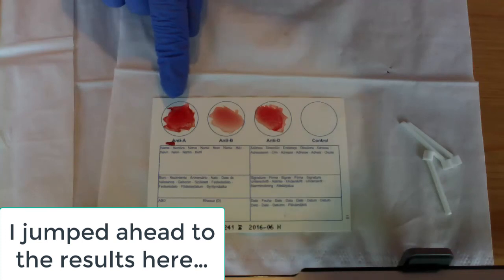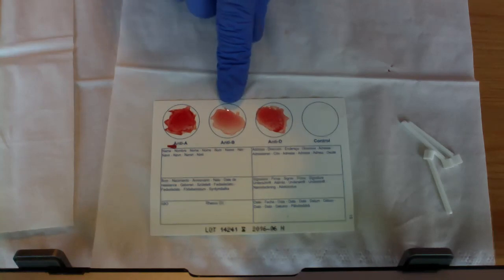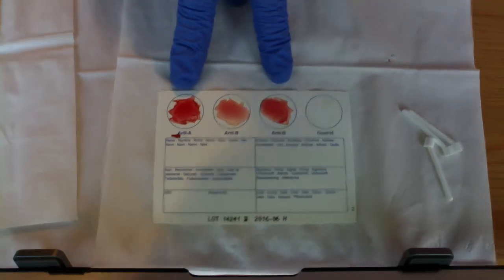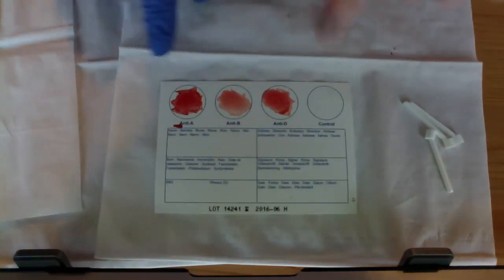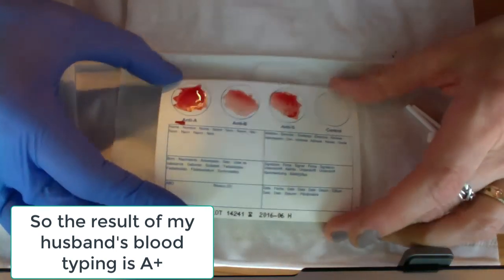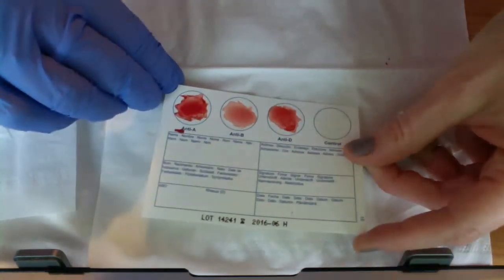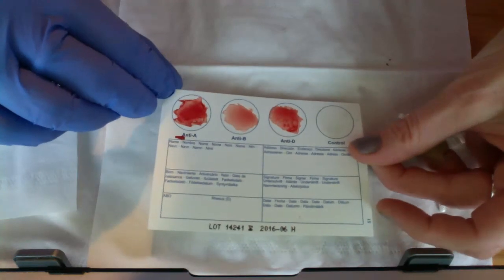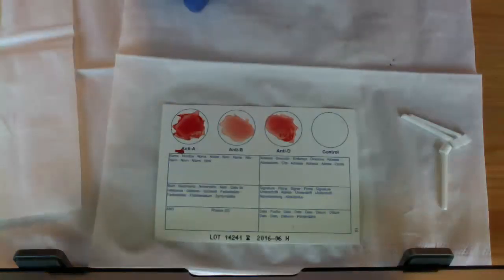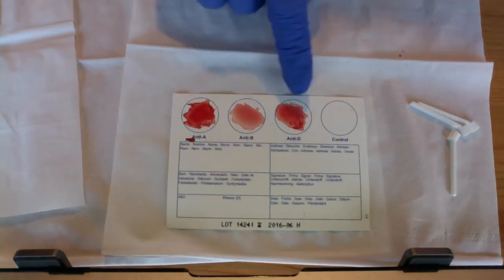So again, here is the anti-A serum that was on the card, anti-B serum, anti-D or anti-RH. And these two are positive for agglutination. You can see that difference in the clumping, and even as I move the card back and forth a little bit, I think you can see those clumps. Let me move that back and forth so you can see those large clumps. And that is exactly what you want to see. So this card would be a positive.